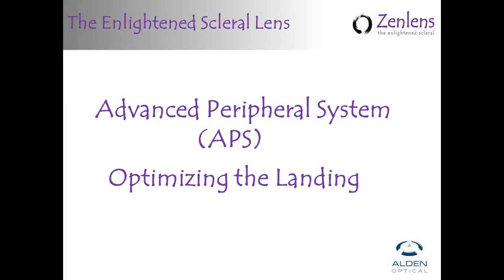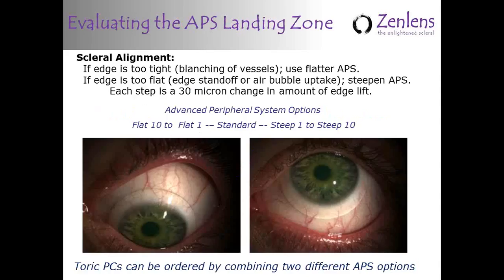So what we want to do now is talk a little bit about probably the most common modification that we deal with when we're doing fittings, which is adjustments to the advanced peripheral system, the landing zone.